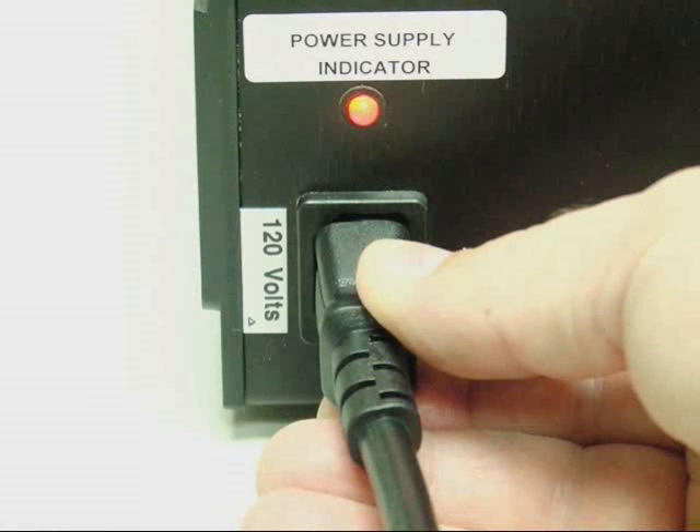The MS-324-AB's rechargeable batteries require 12 hours to fully recharge. Leave the unit plugged in at all times when it is not in use. The fully charged batteries will provide 4 to 5 hours of continuous operation.